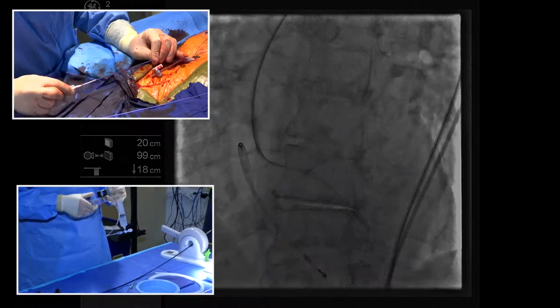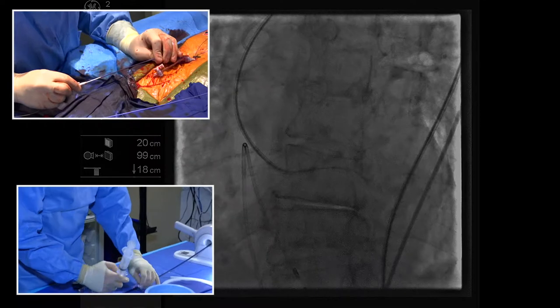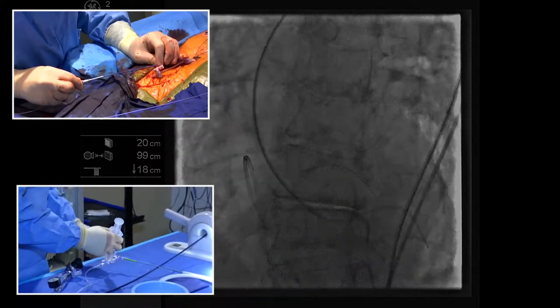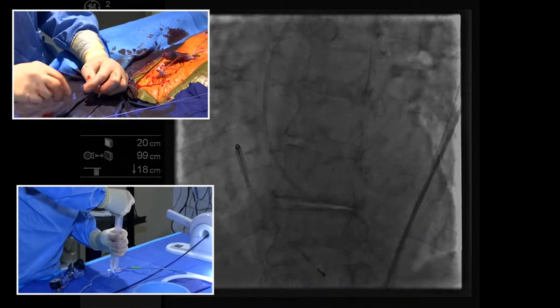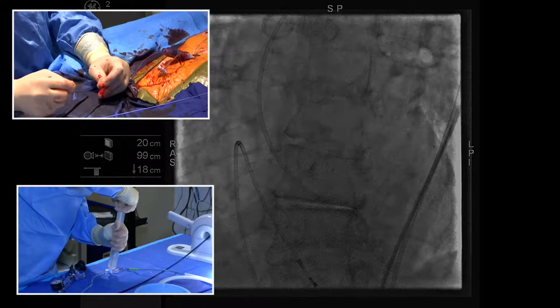This was a Lima, right? Oh, he's on it. That was a good idea. Whose idea was that? Oh, that was my idea. Will it track in is the question now. Oh, come on. Up. There we go. That was hard. All right, give me a J-wire next. I'm exhausted now.